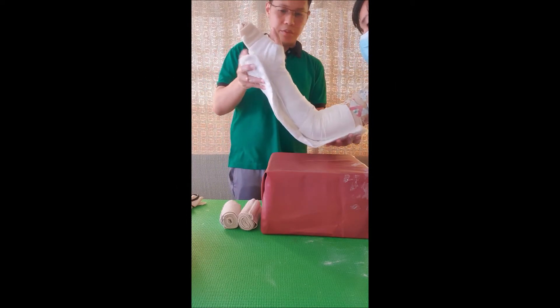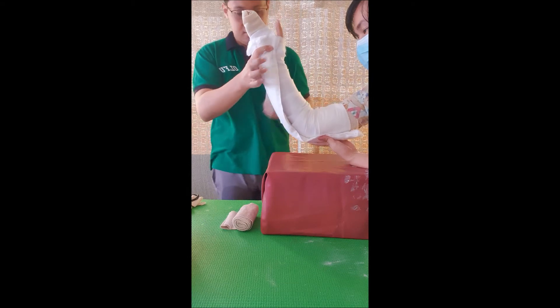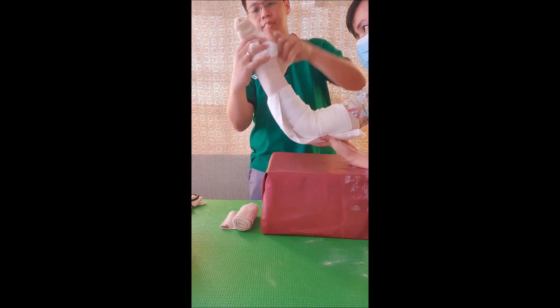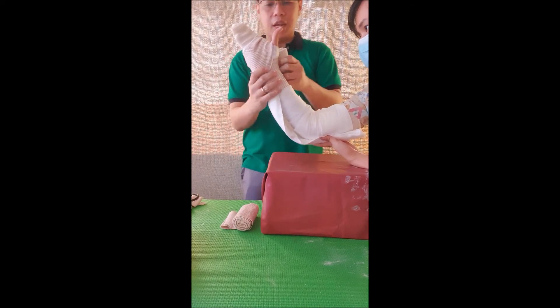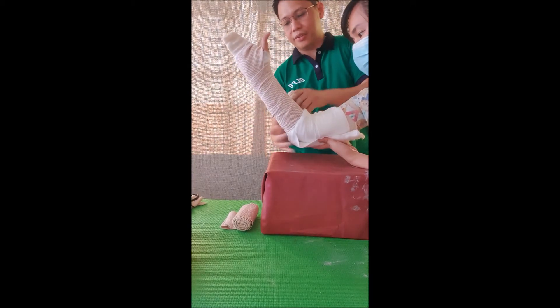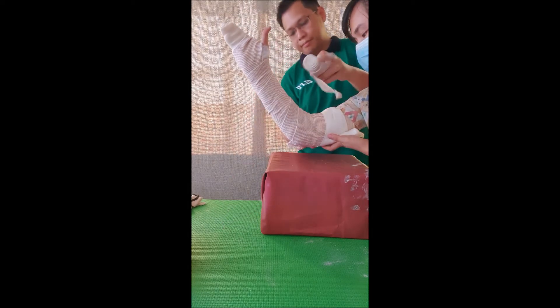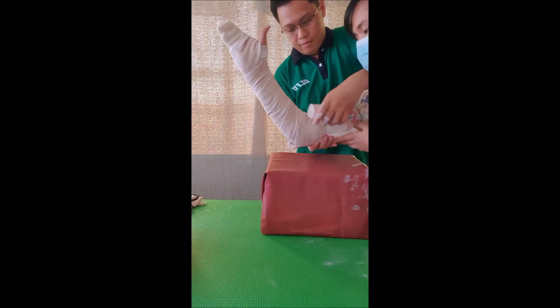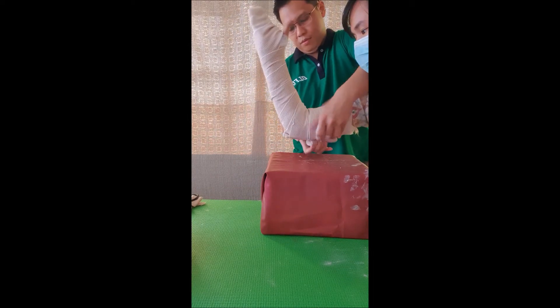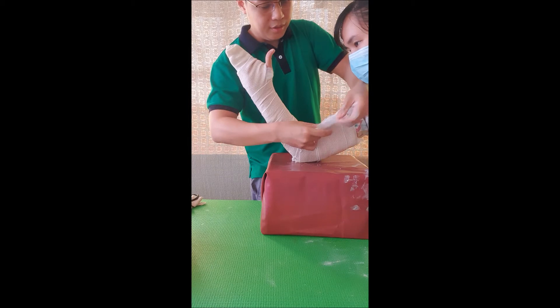We will now place this on our patient and ask our assistant to hold the proximal end. Start with application over the wrist area. For this initial application of elastic bandage, we want to apply it a little bit tighter than normal so that the plaster of paris will mold over the patient.